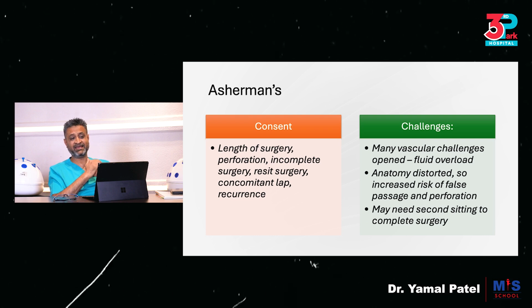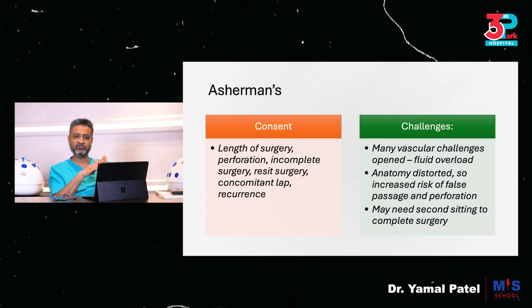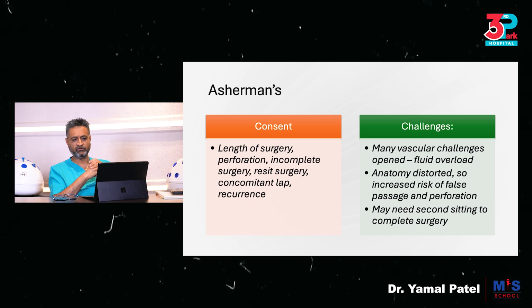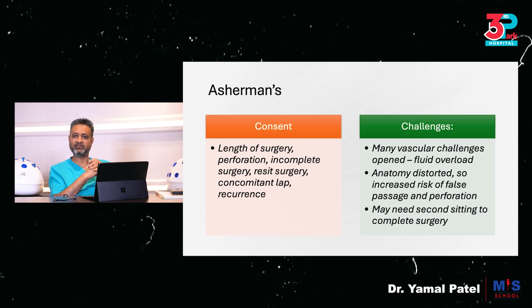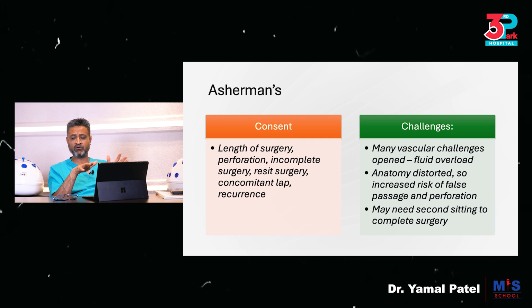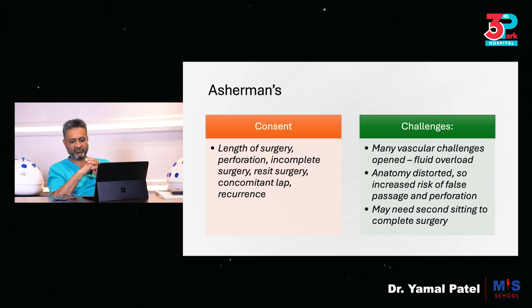But if that happens, we might end up with an incomplete surgery and we might have to do it at a later date. We might need a resit surgery. Many of these procedures may not be complete in one sitting. So you may have to explain to the patient that a resit surgery might be likely, and there's nothing wrong with that. It's just that I'll complete this procedure in bits, so that you don't have too much damage done in one procedure.